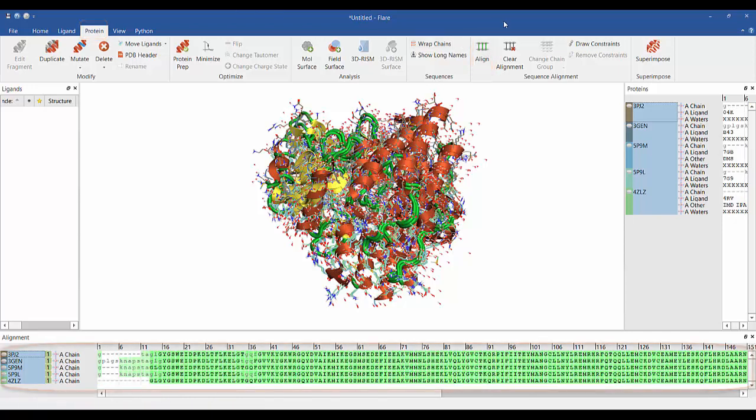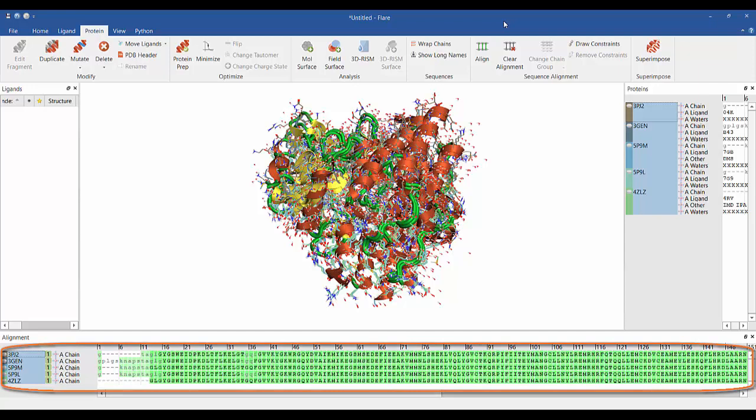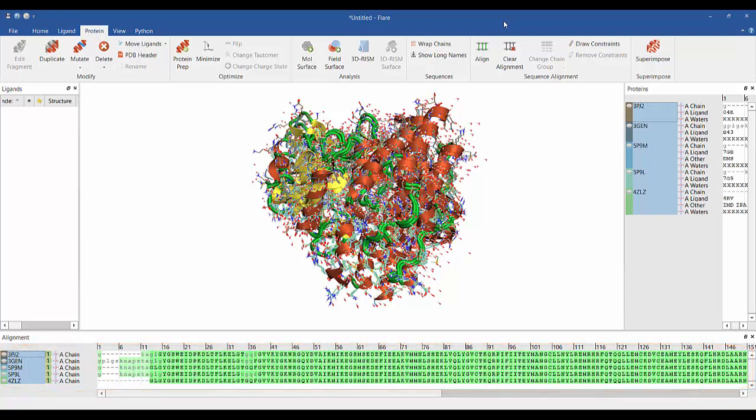In the alignment window, we can see that the protein residues for each protein have gone green, indicating they are now aligned.